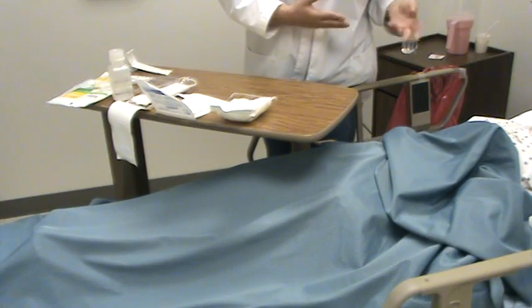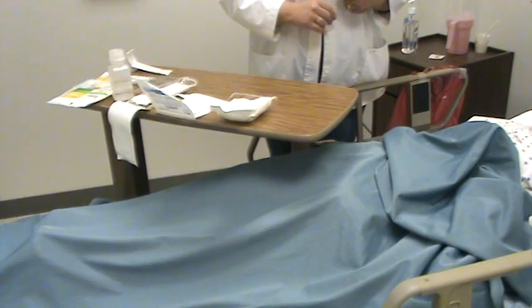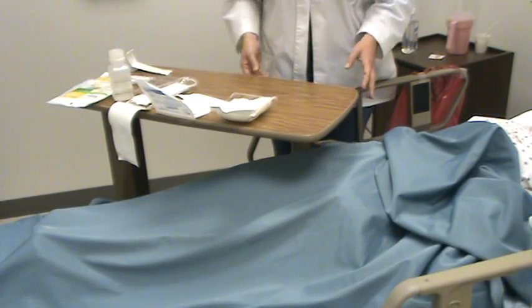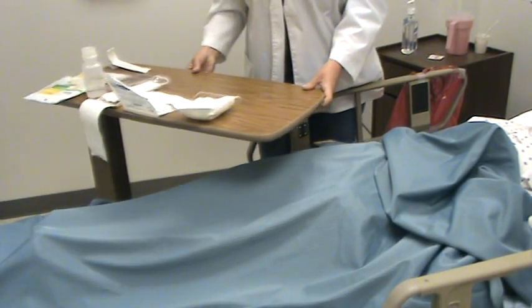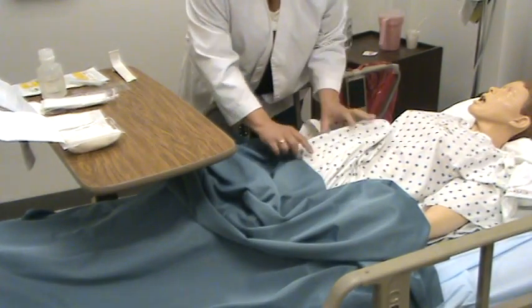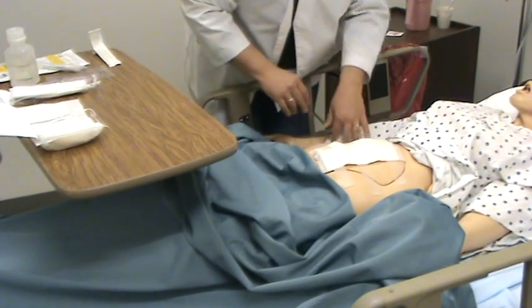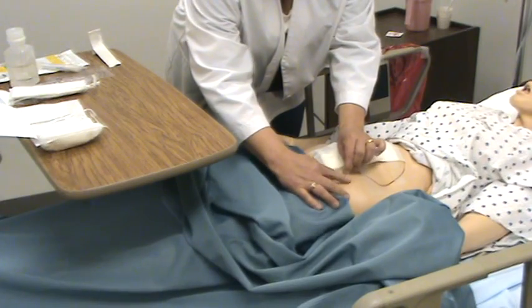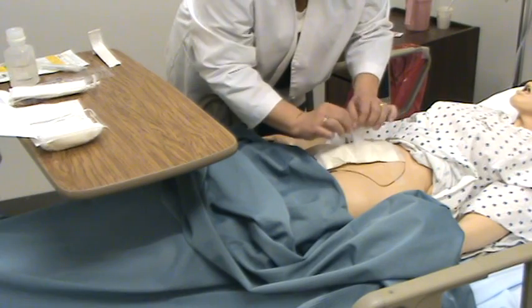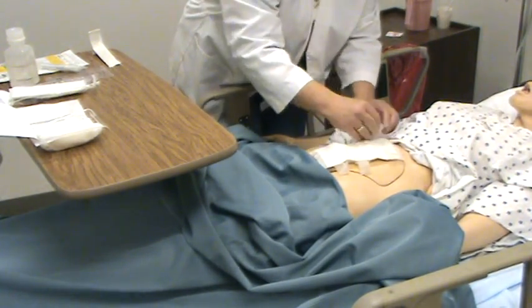Also when you've come into the room, identify your patient by his armband and have him repeat his birth date back to you. See if he's having any discomfort because if he is, make sure you pre-medicate him before you do any of this. I've got my supplies ready. I've checked allergies also because I don't want to be putting tape on here if he's allergic to tape. Make sure you take the tape off the correct way by holding the skin so that you're not peeling a layer of skin off with it.